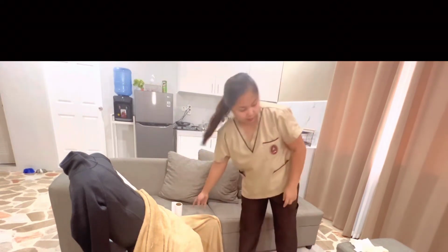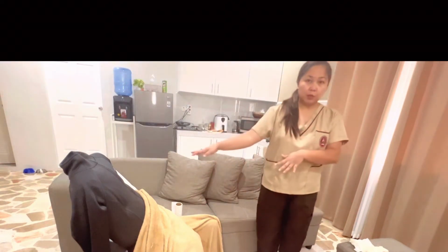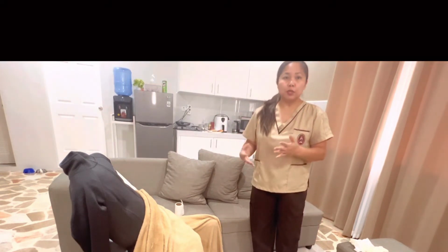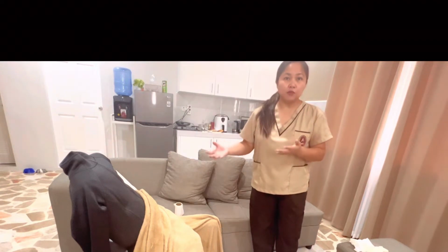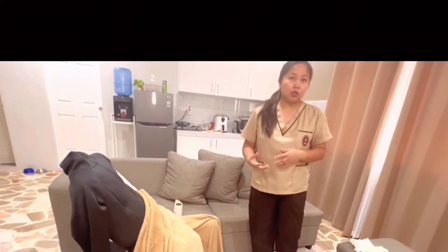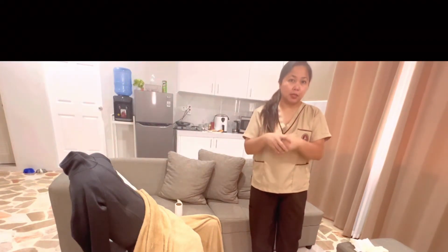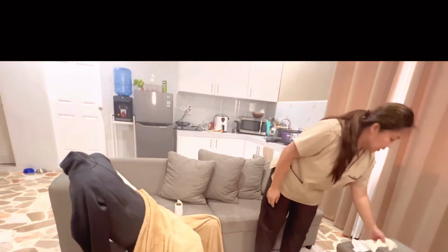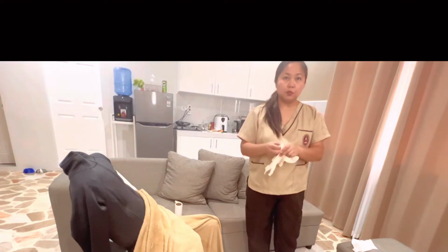Just put it here on the side, and then you can leave the patient to give them a little bit more privacy. And after a few minutes, you would like to check on the patient and see if they're done. And then once they're done, you would like to assist this patient off the commode. So when doing that, you would like to perform your hand hygiene technique again. And then you would like to put on clean gloves for this procedure.